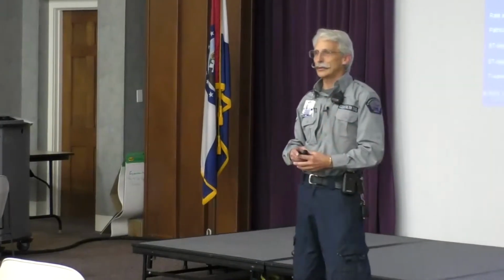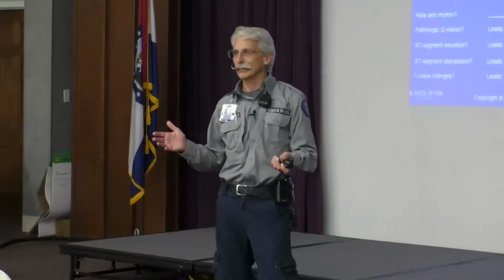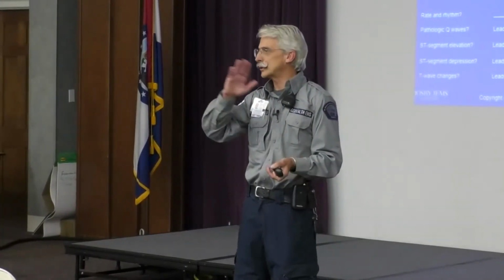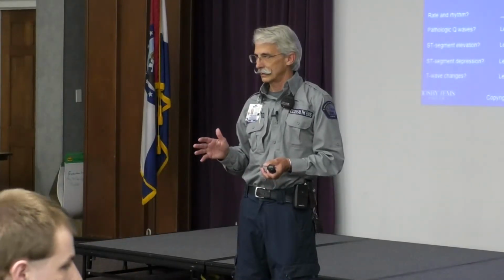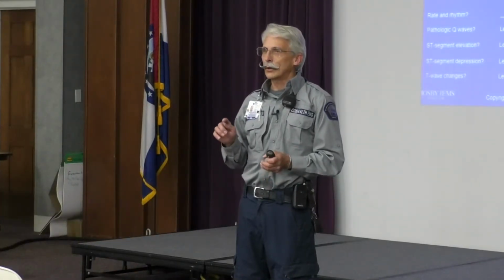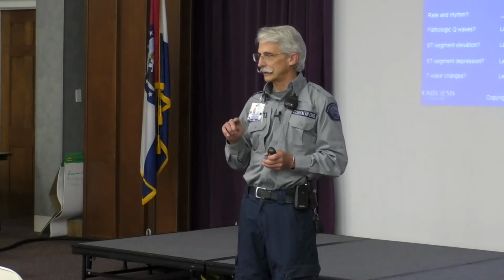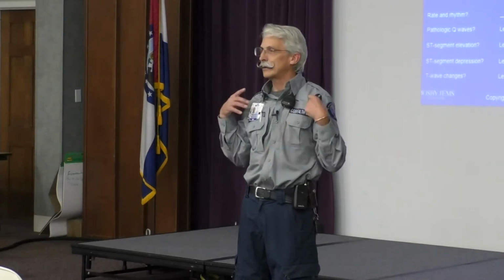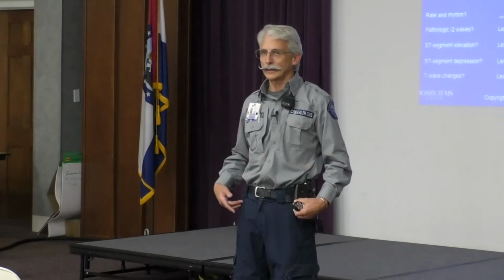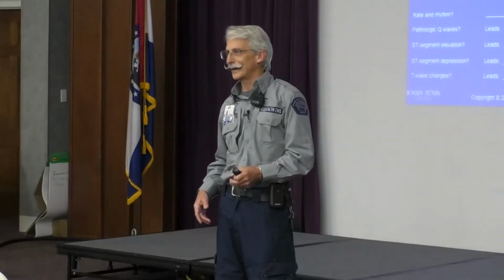Did you know that what you see on the screen is called non-diagnostic mode? The only way we get diagnostic mode is to do a 12 lead. It's the only way. If I only have the 4 patches on, can I do a 12 lead? Can I double punch 12 lead and make it work?